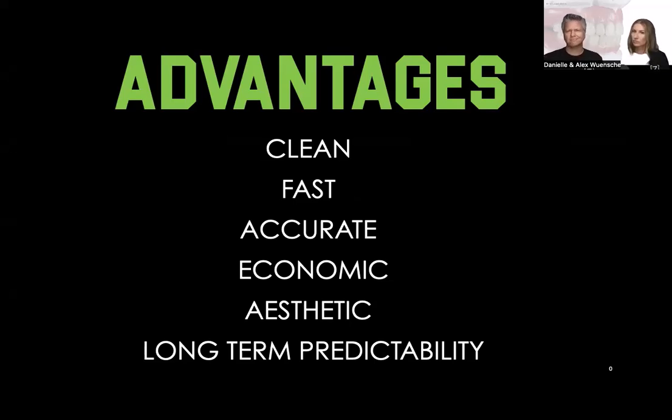But that's not a big deal compared to many others, like a locator restoration where you have to change the nylon inserts sometimes at 6 months in some patients, sometimes every year. It's quite different. So it's pretty intense in terms of maintenance. Here it's actually not. And as far as aesthetics go, it's very highly aesthetic because it gives the patient nice lip support and it hides the transition line really well. Yeah, that's really nice. That's where I see the biggest advantage here.